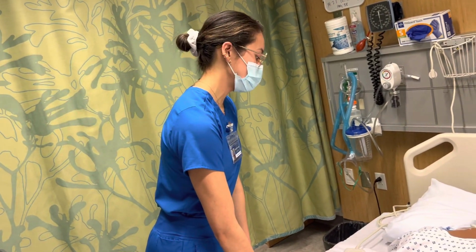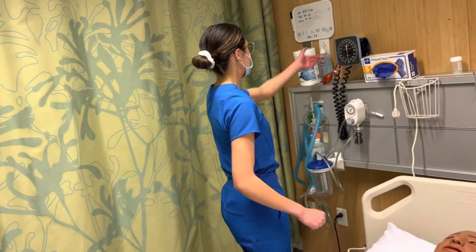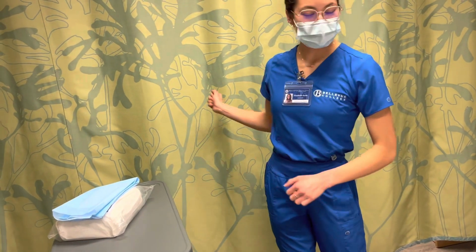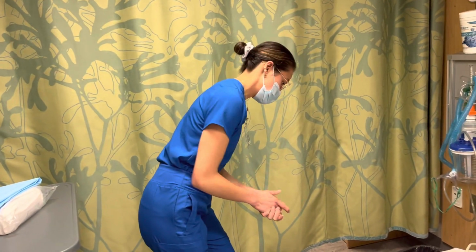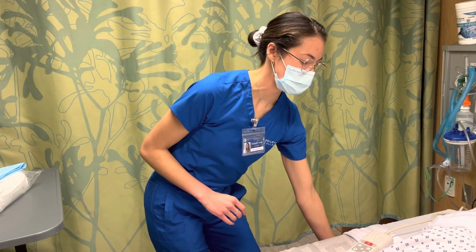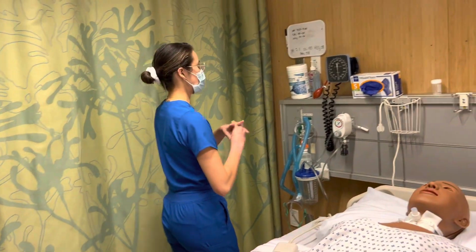How are you feeling? Is the pain medication kind of kicking in at the moment? Perfect. So I'm going to perform hand hygiene, and we are going to provide privacy as well, and we'll bring the patient up to a position of comfort. Alright. So I'm going to put some clean gloves on.